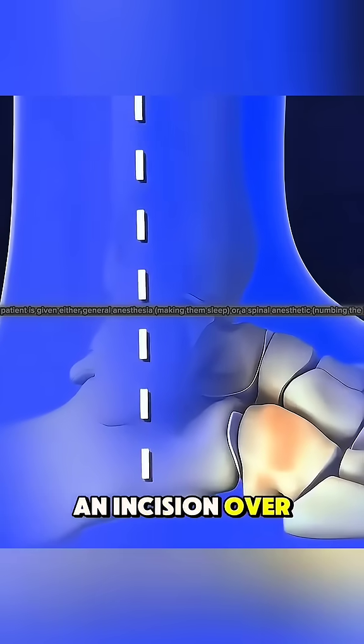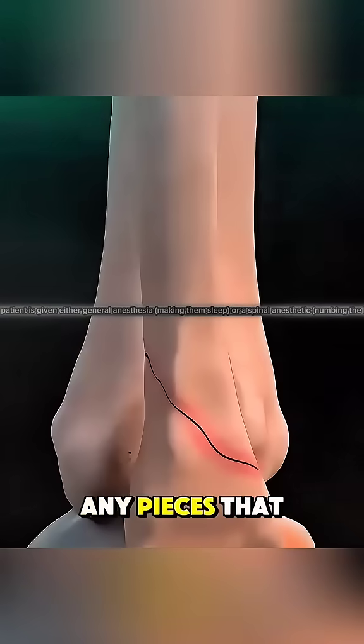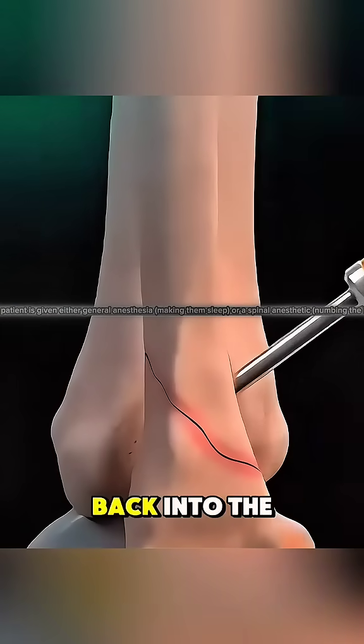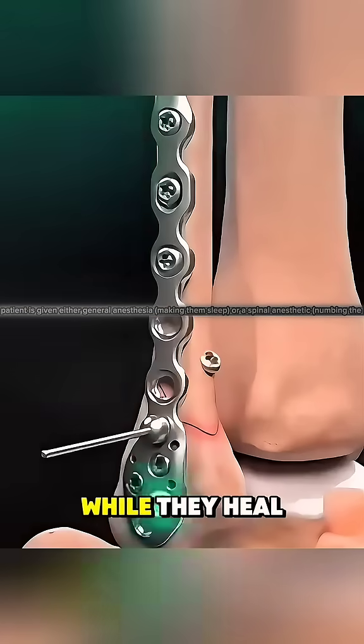The surgeon makes an incision over the fractured area to reach the broken bones. Any pieces that are out of place are gently moved back into the correct position. Then, metal plates and screws are attached to hold the bones securely while they heal.